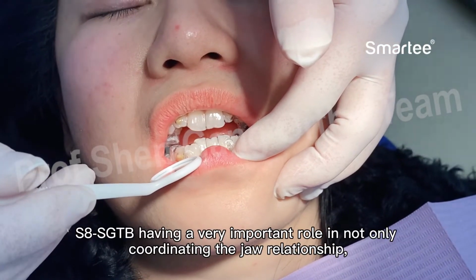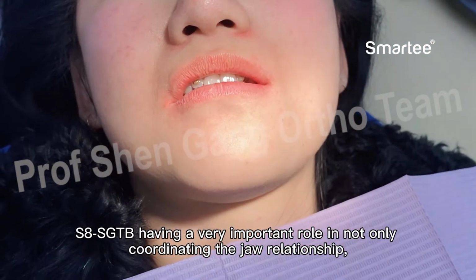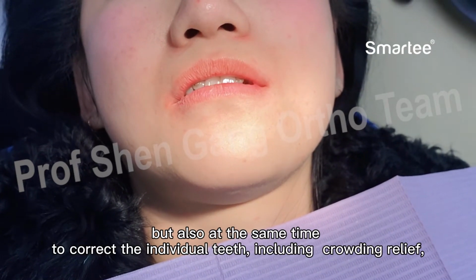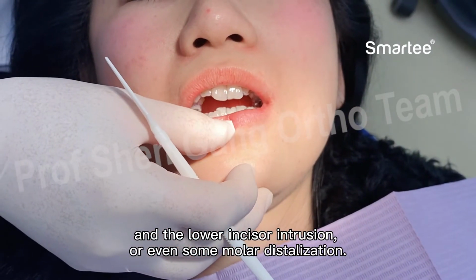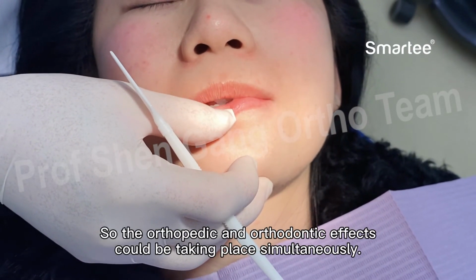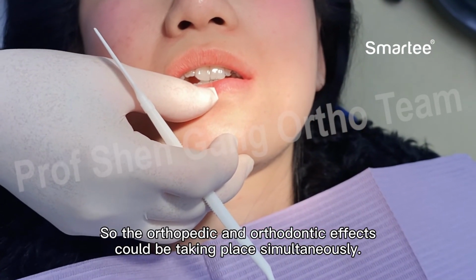The S8 SGTB has a very important role in not only coordinating the jaw relationship, but also at the same time correcting the individual teeth, including crowding relief, lower incisor intrusion, or even some molar distalization. So the orthopedic and the orthodontic effects could take place simultaneously.